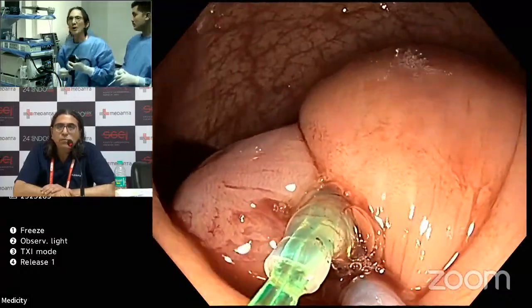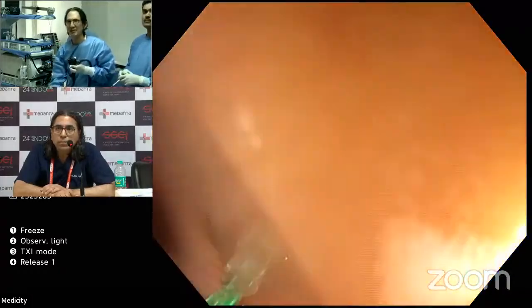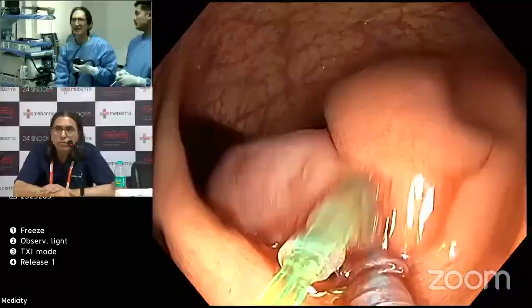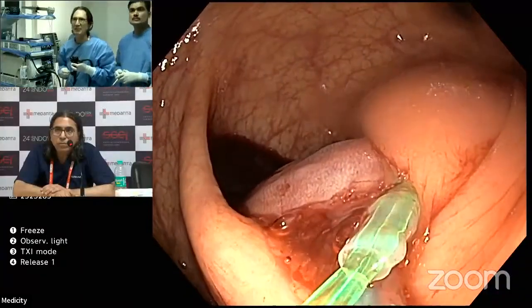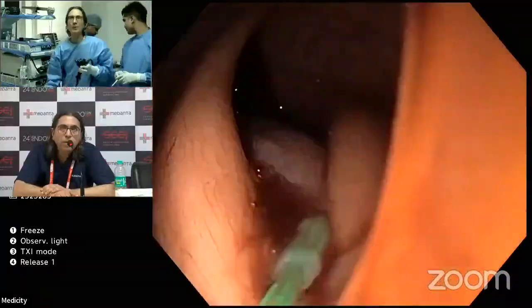So I'm going to do it one more time. It's not a problem. Did you release the Olympus loop? I'm having trouble pulling it off. Yeah, this is the other problem that we sometimes encounter with this loop, is it's hard. There it comes. Okay. I'm going to put one more on there.